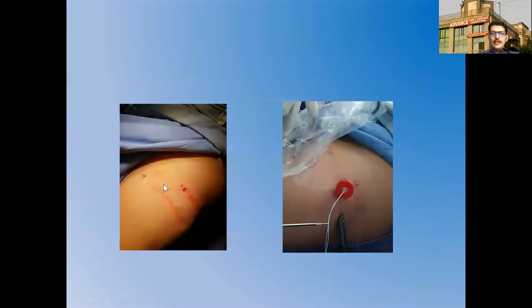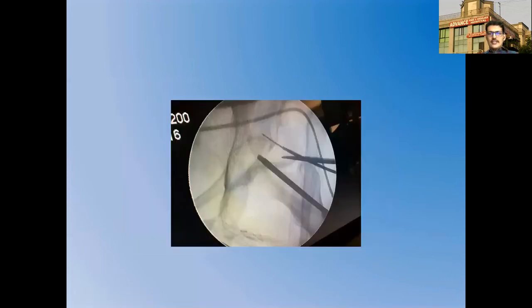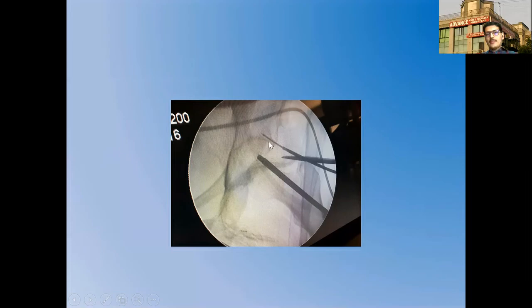Intraoperative pictures show very small incisions with a small cannula, and the push-lock anchor inserted for labral repair is visible. Intraoperative fluoroscopy images demonstrate drilling of the push-lock anchor confirming it is extra-articular. There are occasional case reports of drill migration intra-articularly, so this must be ruled out.